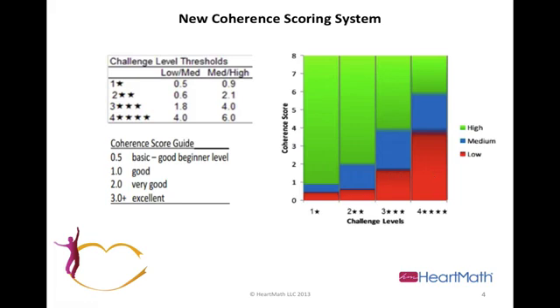And you want to be on the challenge level that's most appropriate for you or the client, so that you're not 100% green all the time or 100% red. You want to be on a challenge level where you have to make an internal state change in order to get rewarded by blue or green.